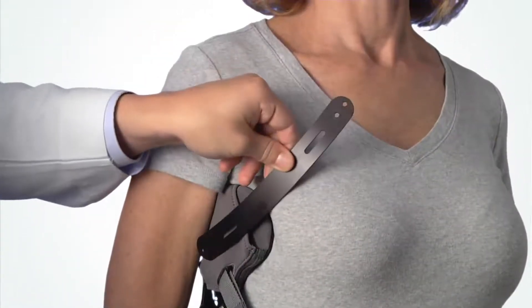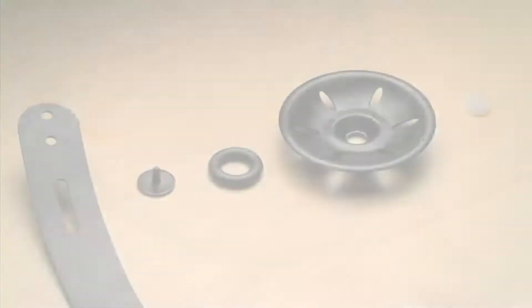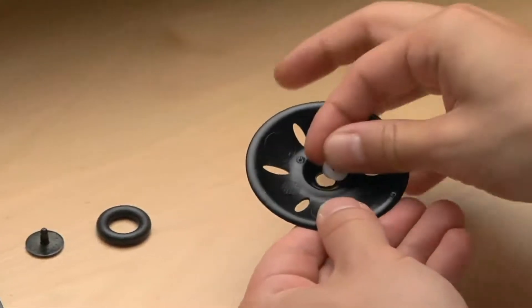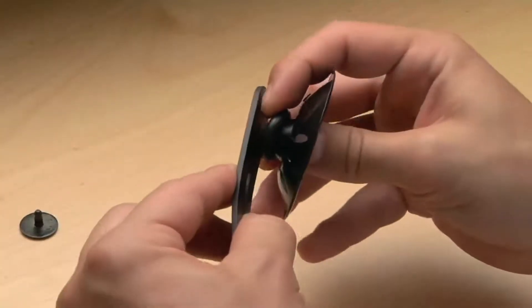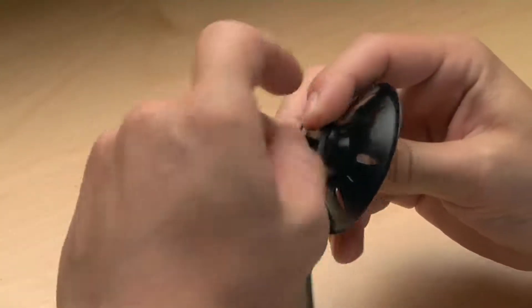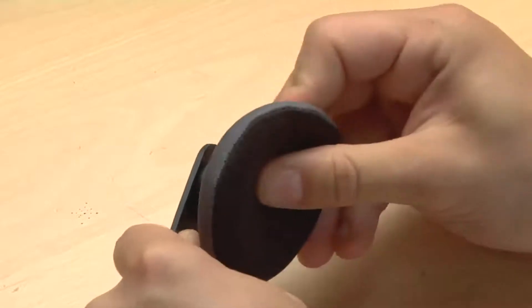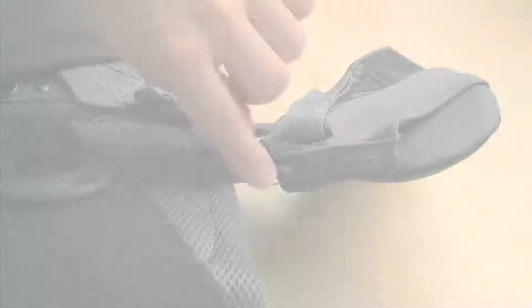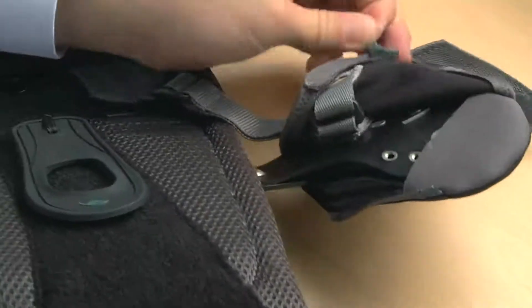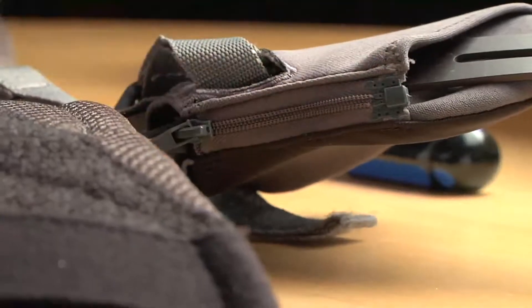If a chest pad is needed, determine which end of the universal chest strut the chest pad will be attached to. Use the male and female rivets to assemble the chest pad disk to the chest strut, then add the foam and sleeve. Note that the chest pad pivots to accommodate varying patient anatomy. Unzip the thoracic pad sleeve to expose the two attachment points, use the two screws provided to attach the chest strut, then zip the thoracic sleeve closed.